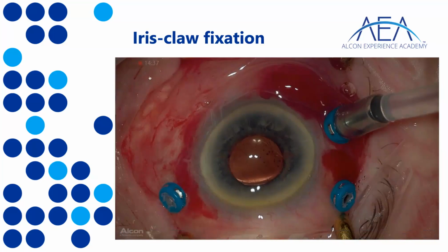So my thinking is, why would I invest, let's say, 1 hour plus of my time to do a scleral fixated IOL, which has exactly the same kind of results as an iris claw, when I can do it in 15 minutes? Now, fair enough, we might argue that here everything was absolutely spot on, and that's not the rule. Fair, good observation. Usually it doesn't take me more than 20 anyway, all right? So that's the kind of time which is needed to do an operation like this.